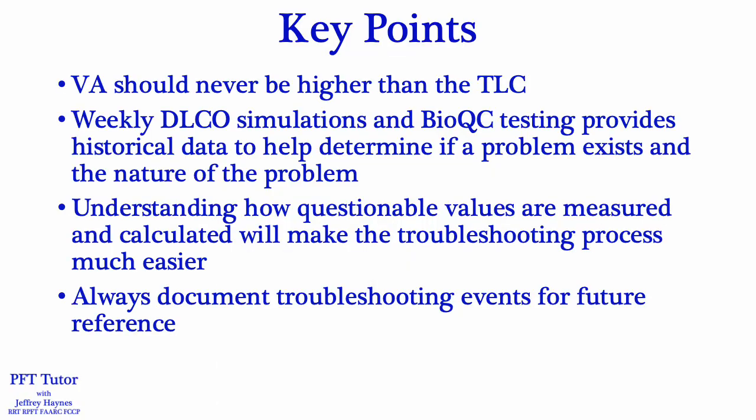Key points: the alveolar volume should never be higher than the total lung capacity. That's physiologically impossible. Weekly DLCO simulations and BioQC testing provide historical data to help determine if a problem exists, and if so, what the nature of the problem is. Understanding how questionable values are measured and calculated will make the troubleshooting process much easier, and always document troubleshooting events for future reference.